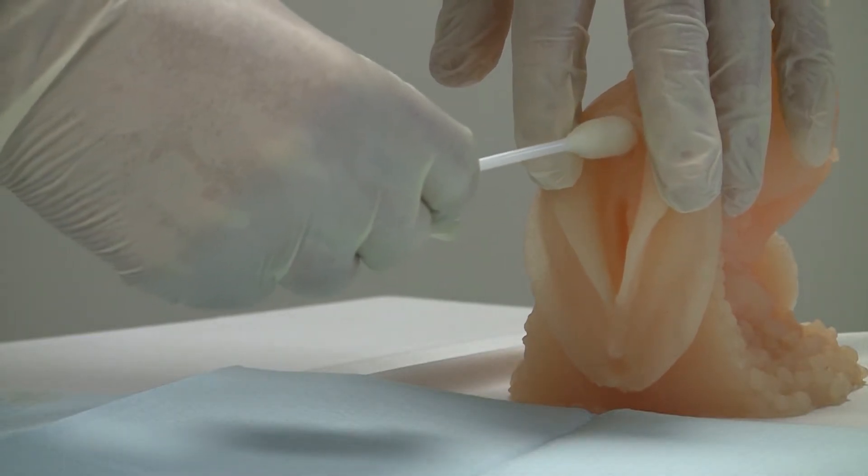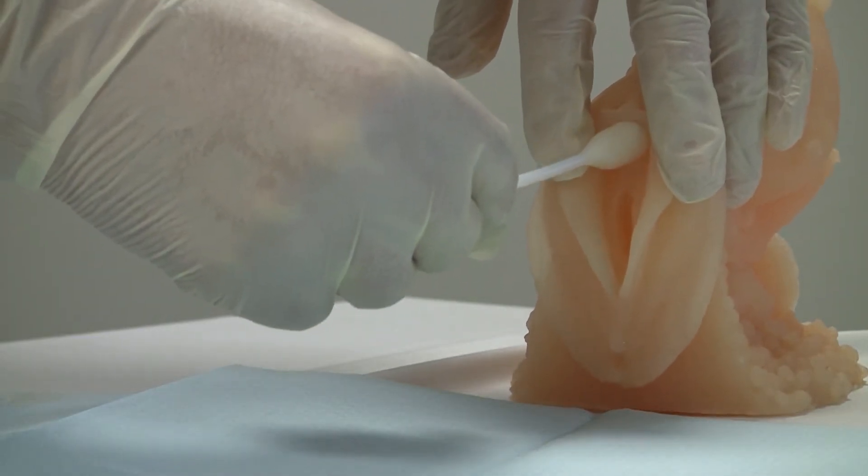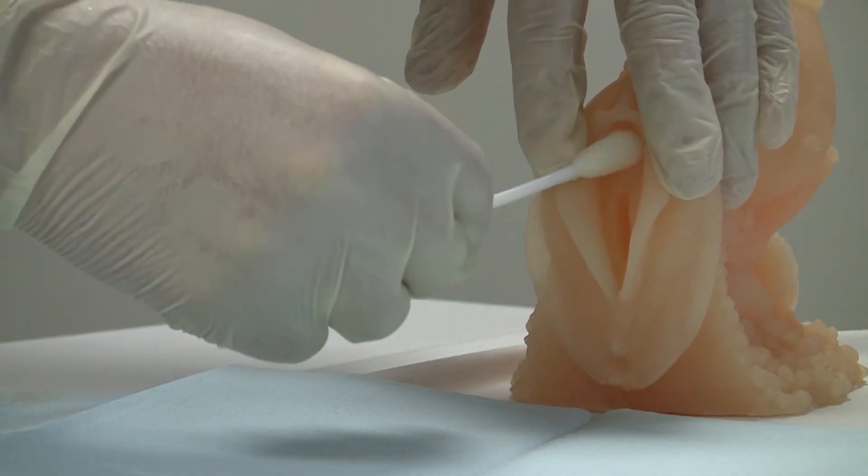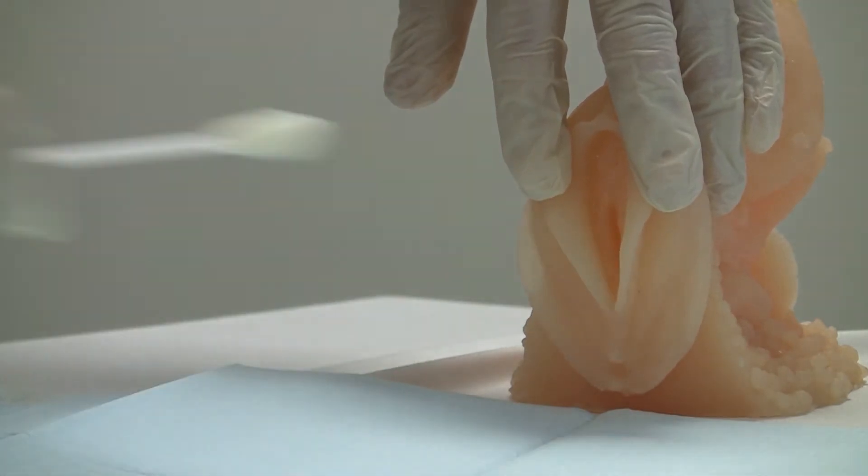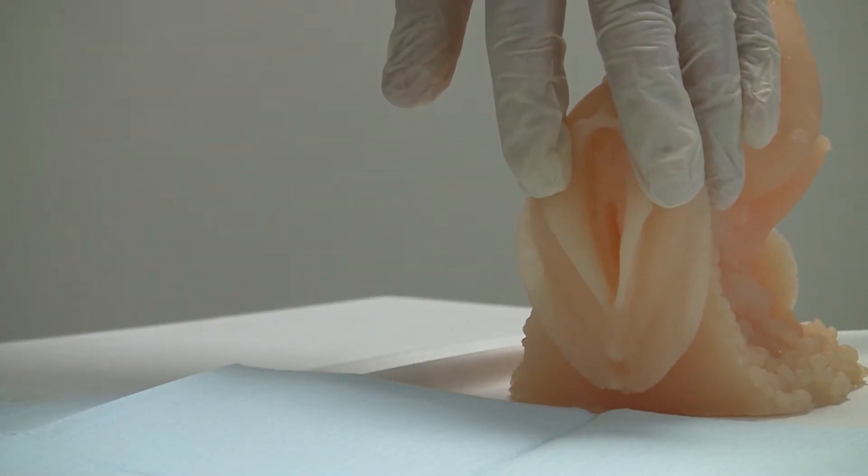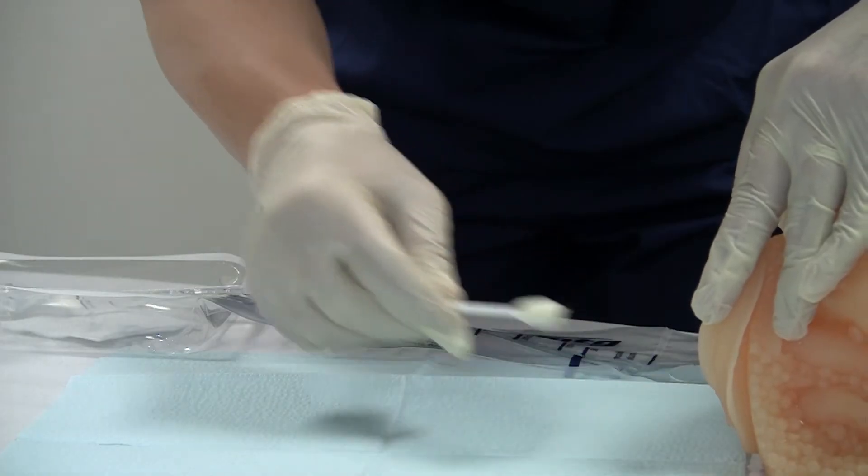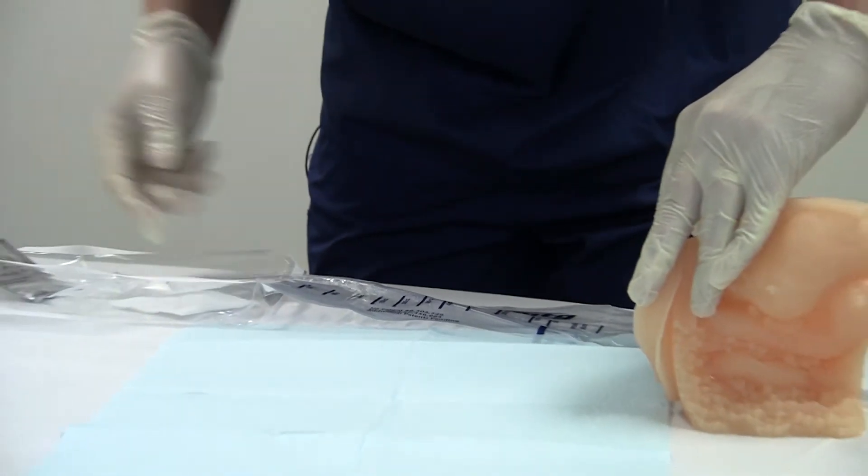I'm going to take each swab and I'm going to start right above the urethral opening and wipe downward one time with each swab. Don't retrace the same skin with the same swab stick. There's no iodine, so it's less messy for sure.